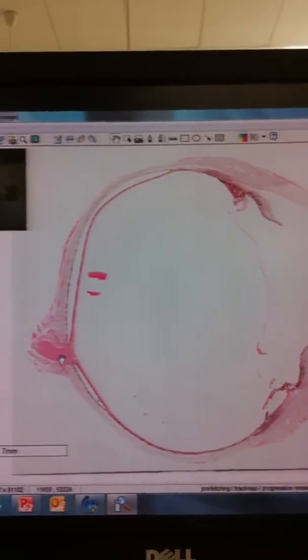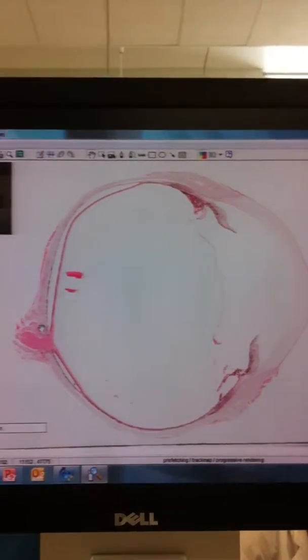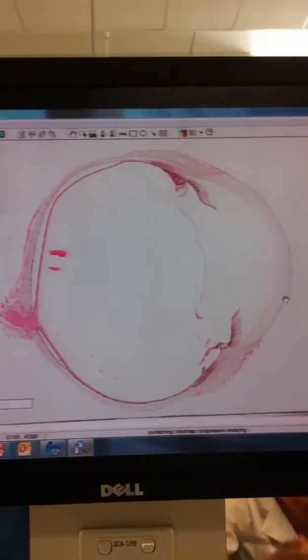Nervosa where the optic nerve leaves. You can see it leaving just there. It's a meningeal sleeve, the dura mater, around the optic nerve. So we'll look at these structures in detail in higher power in a second, just to orientate yourself.